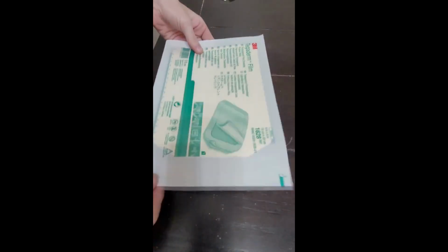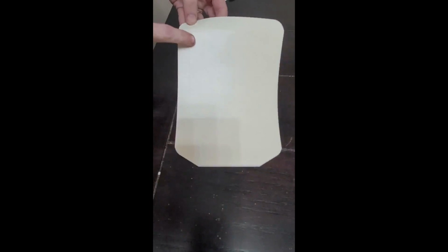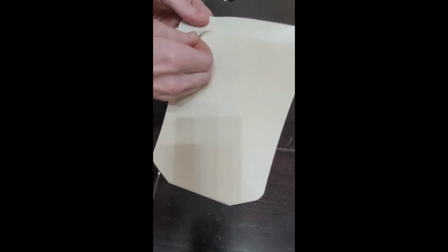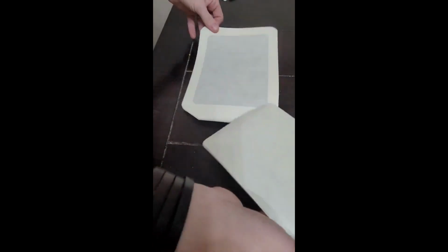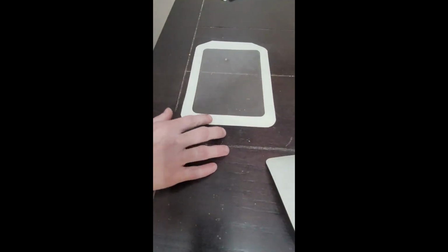Okay, so I have my flat surface, my Tegaderm. This is a 6 by 8. I do use 3M. Okay, so at this point, I locate where that window is, and I'm going to take that out. Now this is the sticky side, sticky side up. What I have found works the absolute best is 2 squares of toilet paper.